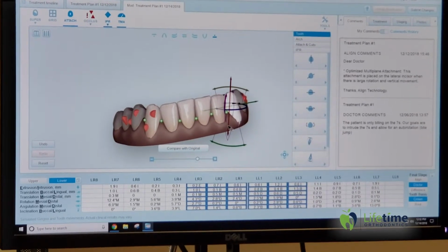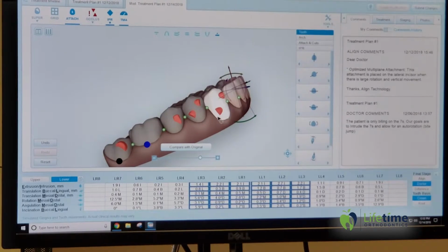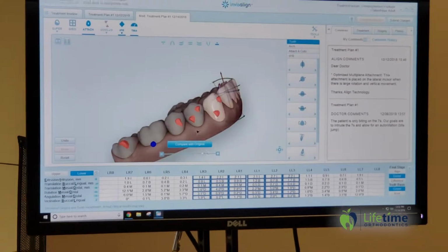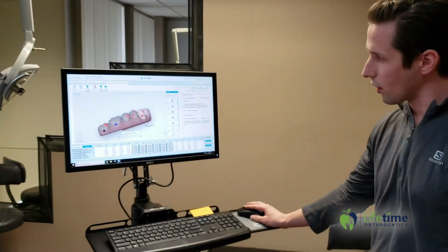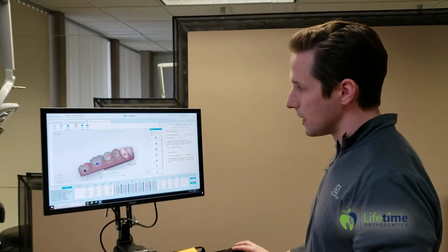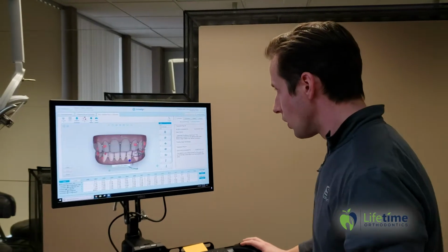And I think this is pretty good here. That's about 2 millimeters of intrusion. Am I actually going to get that in my mouth? No. I might get 0.5 millimeter to 1 millimeter, but I kind of want to create this reverse curve here, if you can kind of see this arch, okay? That's going to kind of help open my bite and help to create contacts on these teeth where there's no contacts currently, okay? In the front, this looks pretty good.